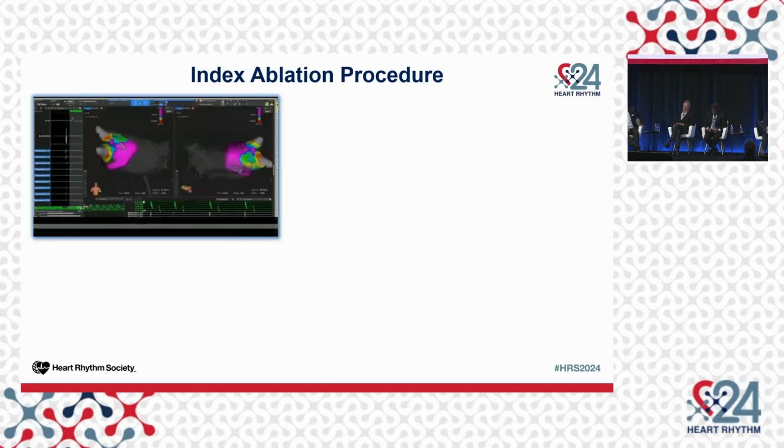And so here you can see on the left the video just showing how you can use this catheter to make a really high resolution, high fidelity baseline map fairly quickly using a 3D mapping system. And you can delineate your anatomy. And it's really nice to have one catheter that does both things so you're not exchanging catheters, and it also decreases the cost per case when you're not using multiple catheters.